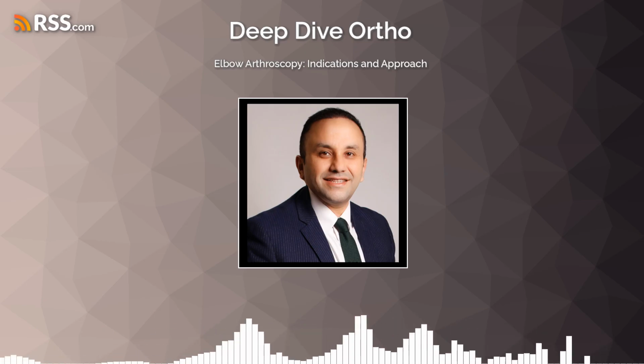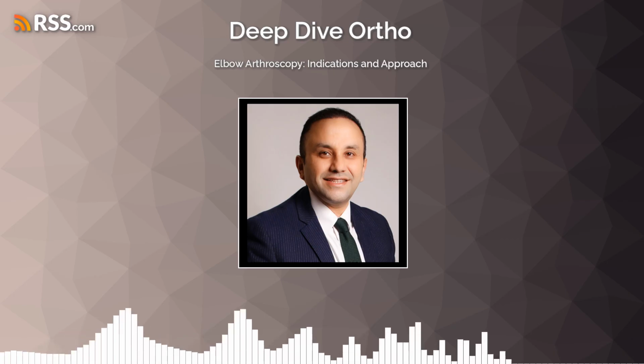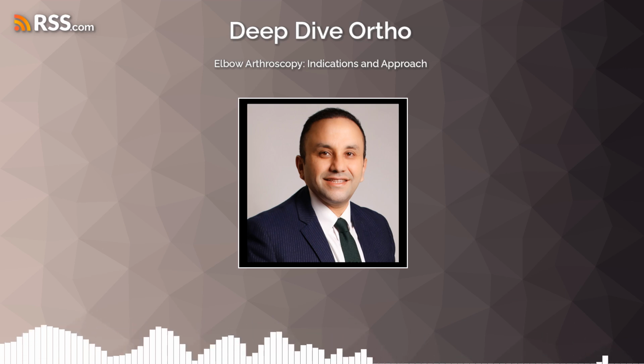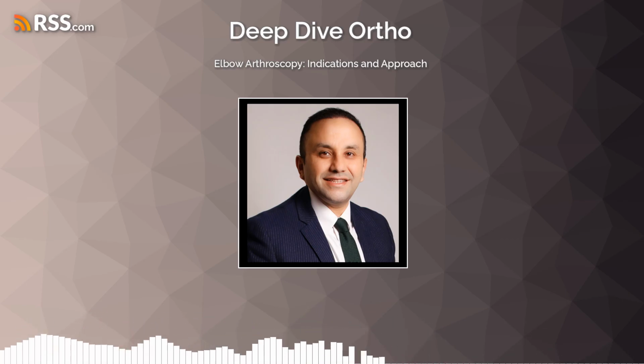So once diagnosed, how is PLRI treated arthroscopically? Can you repair it minimally invasively? For arthroscopic treatment, for patients with functional impairment that's resistant to non-operative treatment, arthroscopic LCL complex repair and plication techniques have truly evolved. For acute or chronic avulsion from the humeral origin, an arthroscopic repair can be performed.